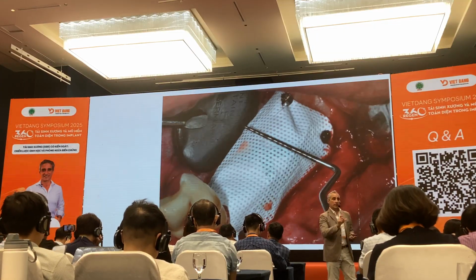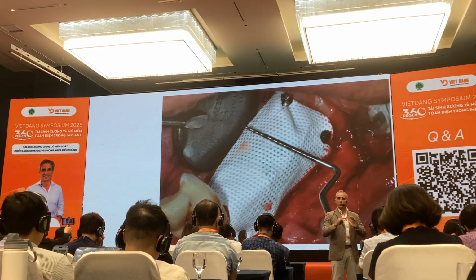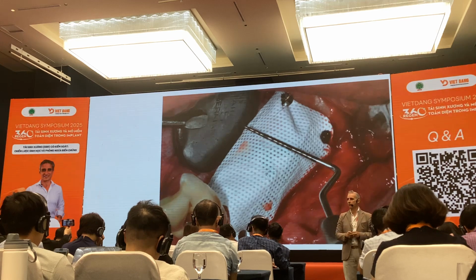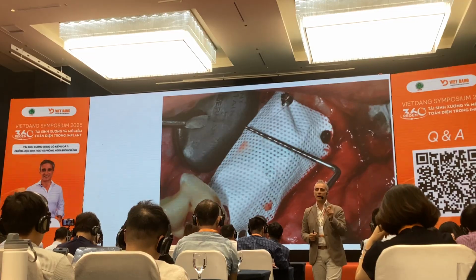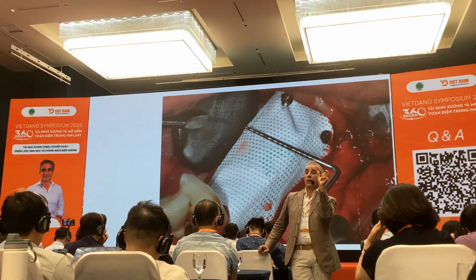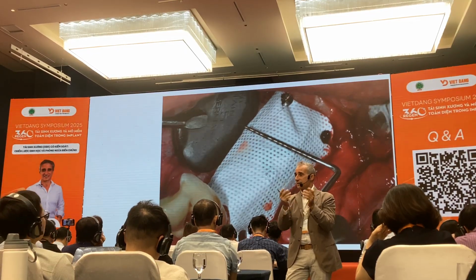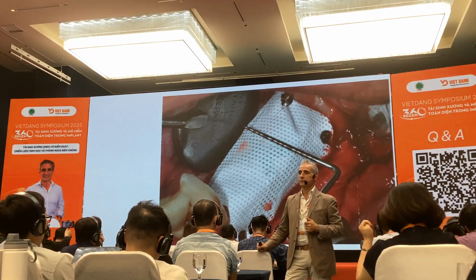is the ideal width in order to protect the bone and the implants, 1.5 to 2 millimeters on each side of the implants, if we place an implant with 5 millimeters of diameter. 5 millimeters of diameter plus 2 millimeters on each side is 9 millimeters, plus the 3 millimeters that we could lose makes 12 millimeters.